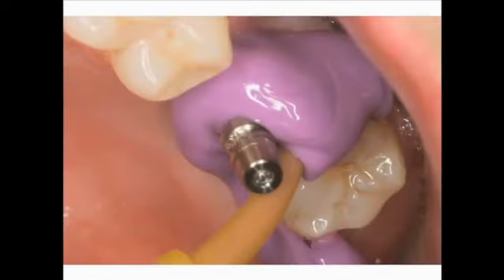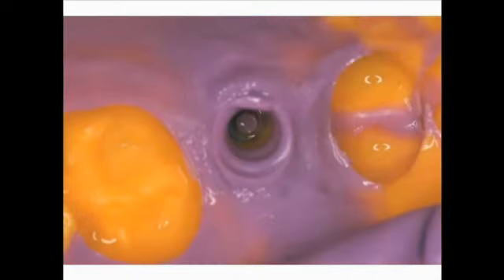A polysiloxane impression is made using light and heavy body materials. A nice clean impression of the impression coping is made. Now, if you look at this impression, you can see on the very top of the impression where the implant would be, you see a flat area. And the impression coping does have a flat side to it, so it allows you to replace it quite readily.